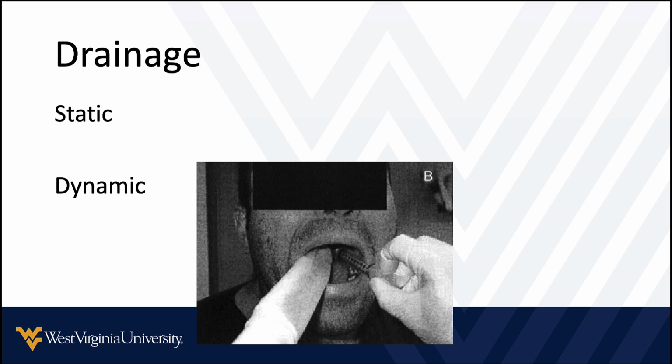Now, when you drain it, you can do this statically. If you identify the abscess, you want to take note of the exact placement of the probe, the directionality, the depth, and get yourself fairly confident in where that needle needs to go based on your ultrasound. And you can just put the probe to the side and then drain this. So that would be a static technique, and that works pretty well in most scenarios.